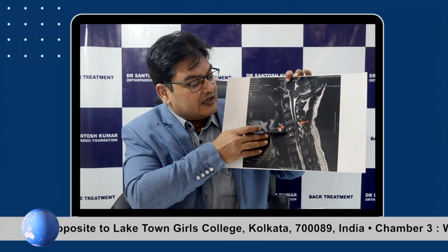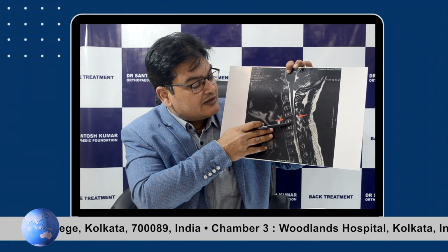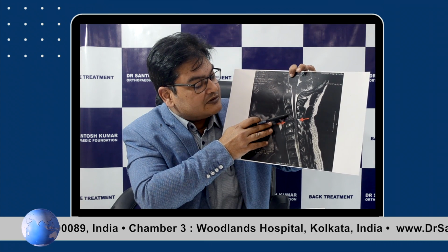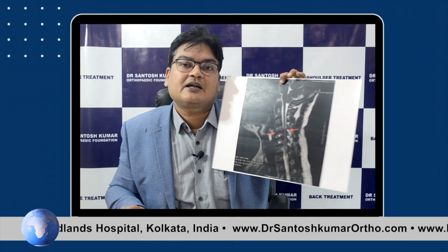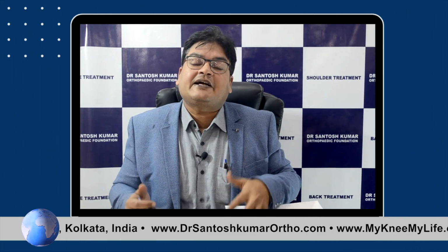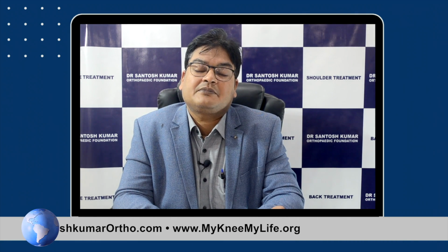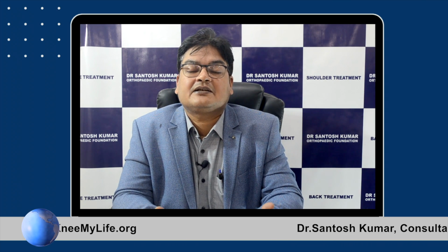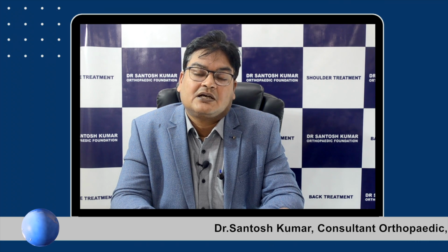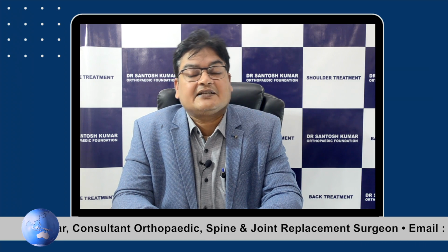This is an example of an MRI where there are multiple level disc prolapses. There is a disc prolapse between C5, C6, there is a disc prolapse in C3, C4. So multiple level disc prolapses are there, and all these things can be made out in MRI. Now, as I told you, more than 95% of times it can be managed just with medicines, and we have to give some time, and most of the times people get well with time and medicines. But if it is not happening, then we have to do surgery, or else in conditions like neurodeficit when weakness has appeared, we have to do surgery.